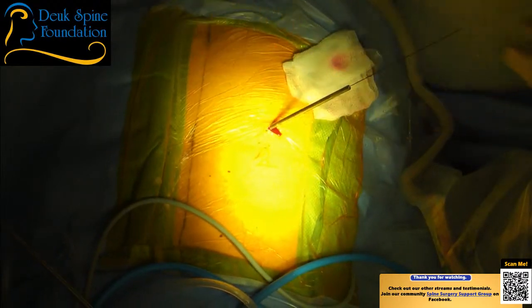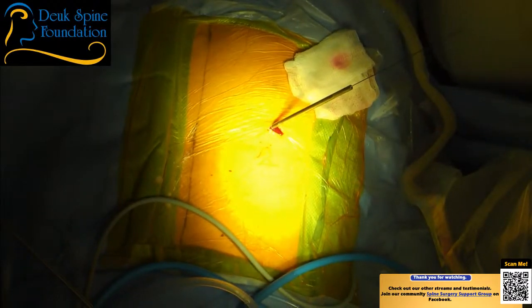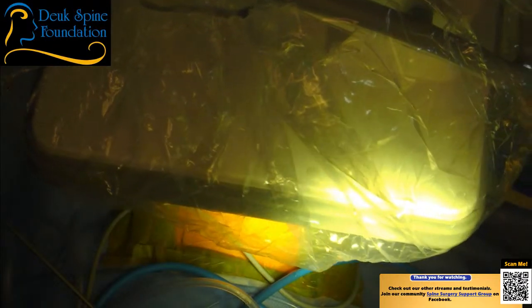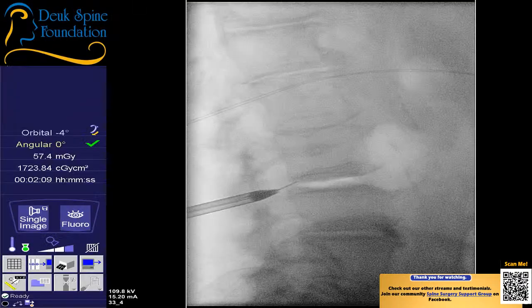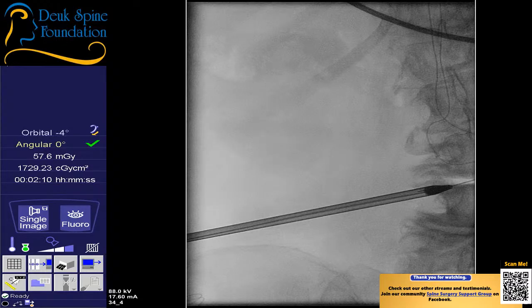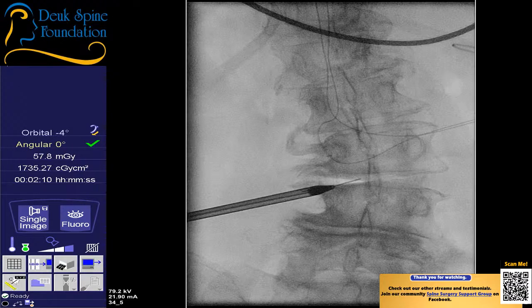All right, let's see where we are. Let's go with an AP. So the reason I'm not getting aggressive with the mallet, banging this thing in, is because I'm not really anchored well at the end. I'm just at the back of the disc, barely hanging on. I don't want to start banging this thing because it'll shift the end point, which is my final destination. And I don't necessarily want to shift that out of its current position, even though it looks a little medial, but it really isn't. It's just the rotation.